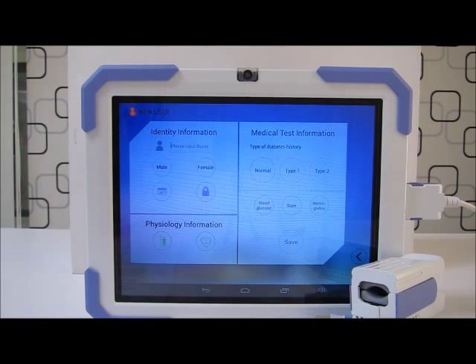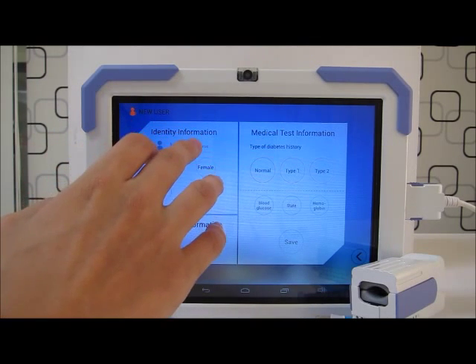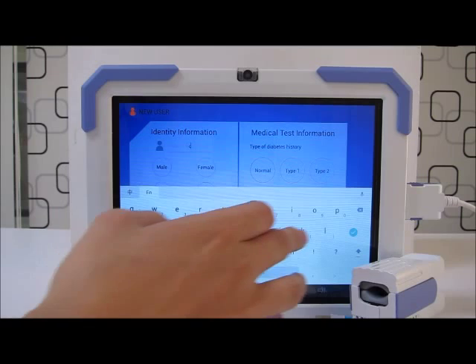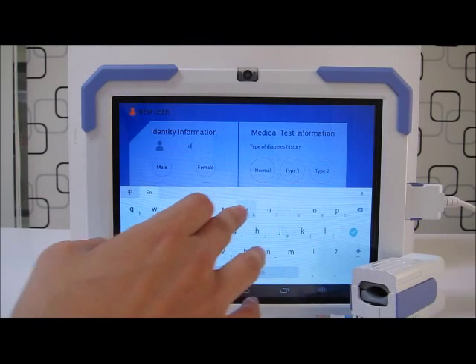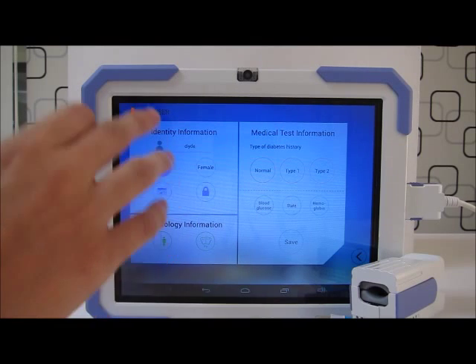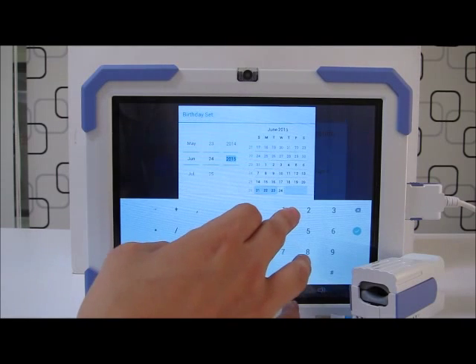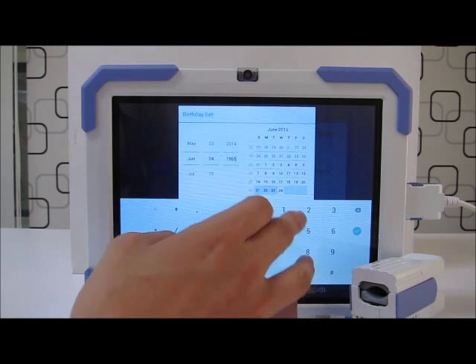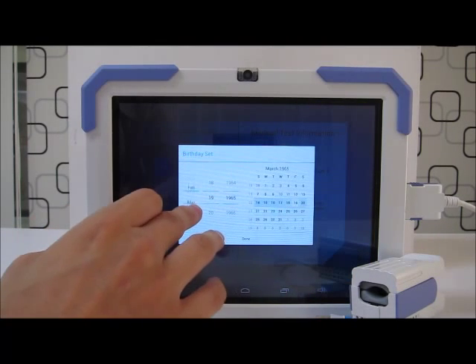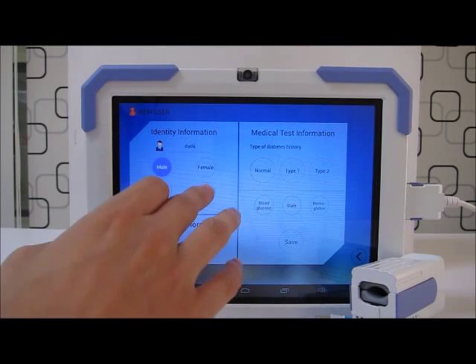To insert all the information accurately for the result to be more accurate. So I will input my name, my gender, my birth year, my height and weight.